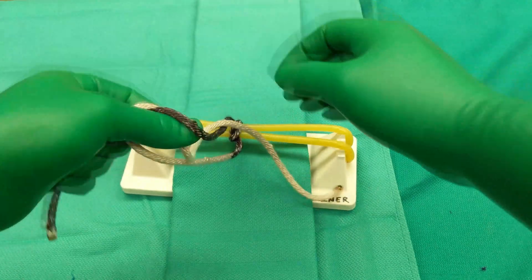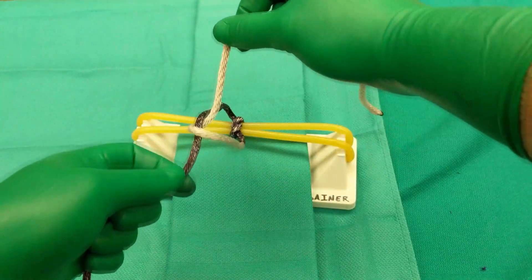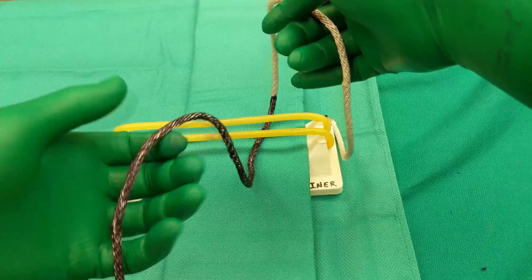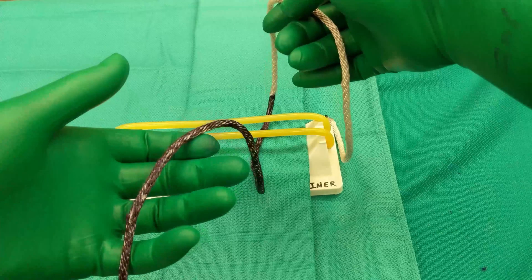Pinch and pull through the loop is repeated. Remember, your hands alternate directions, so the left hand comes towards you again and the right hand goes away to tighten the knot. One more time, a little faster. Remember, for a two-hand tie, your left hand is closest to you to start.